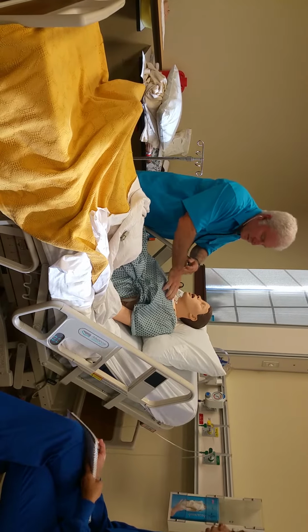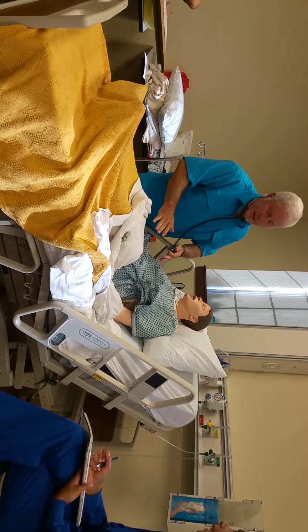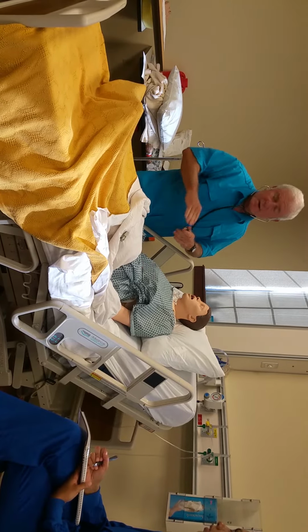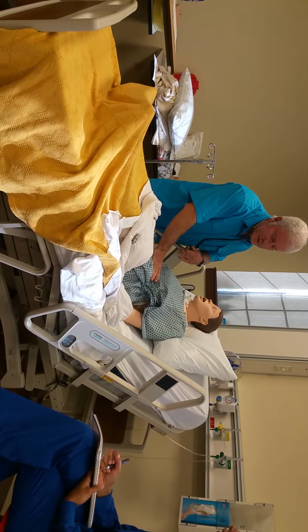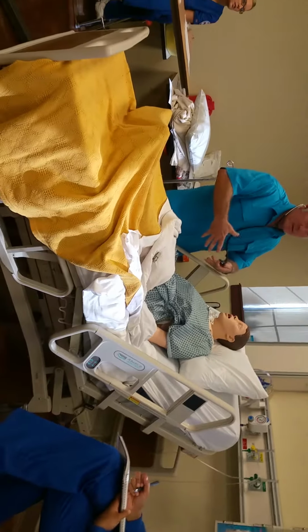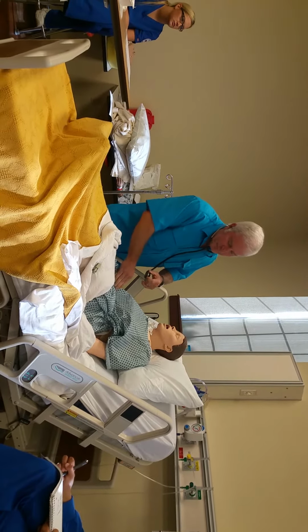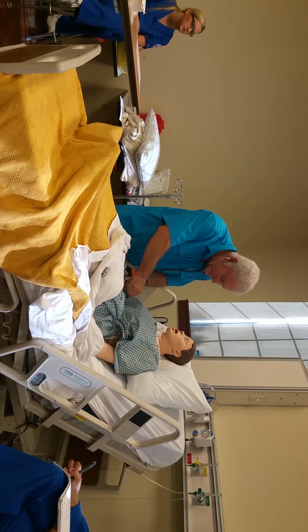So now I've listened to the heart and the lungs. You want to look, listen, and feel for the abdomen. So I'm going to look. And since I'm putting an NG tube in, we're going to pretend, even though when you do your assessment it can be flat and soft, that because he needs an NG tube, it's rounded and firm. It's distended. It's filling up, and that's why we have the NG tube to decompress. He told me already that he's hurting right here, so I'm going to keep a mental note of that.